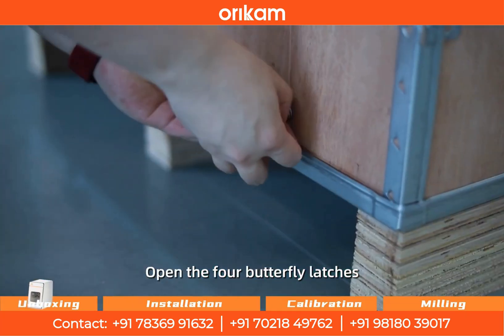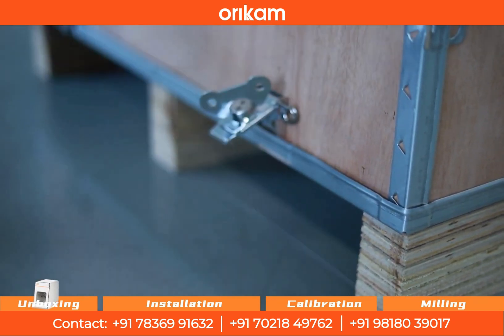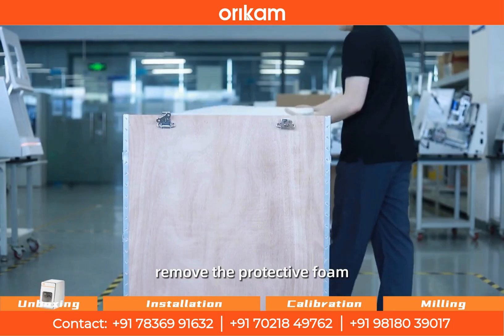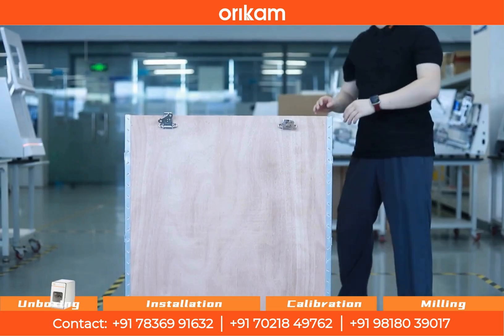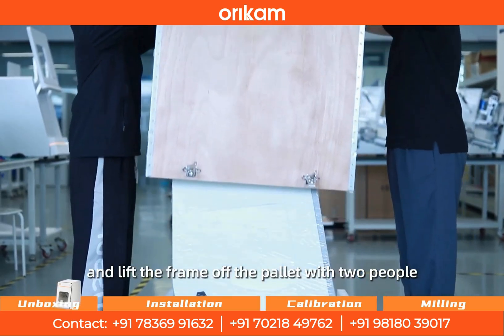Open the 4 butterfly latches at the bottom of the wooden crate, remove the protective foam, and lift the frame off the pallet with two people.